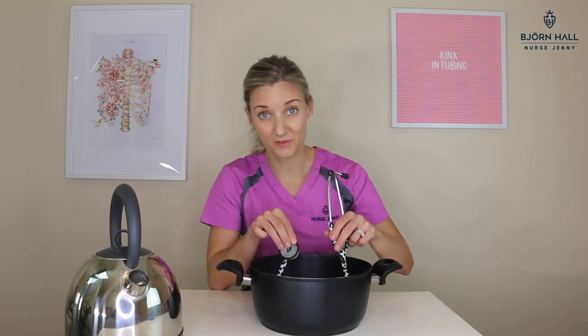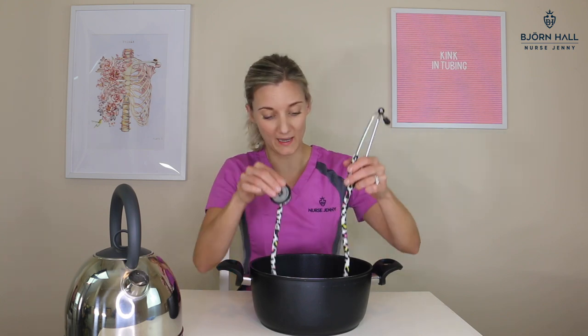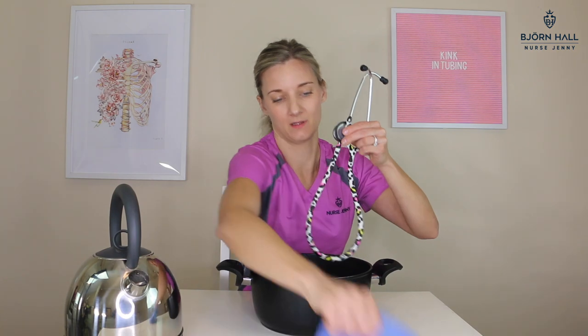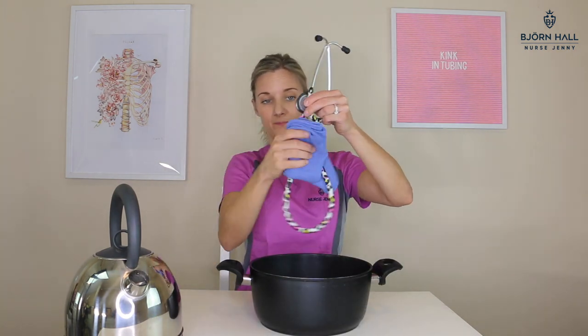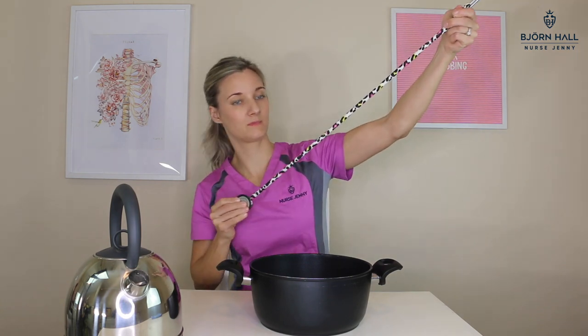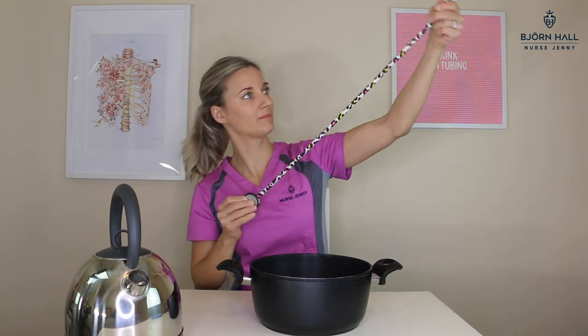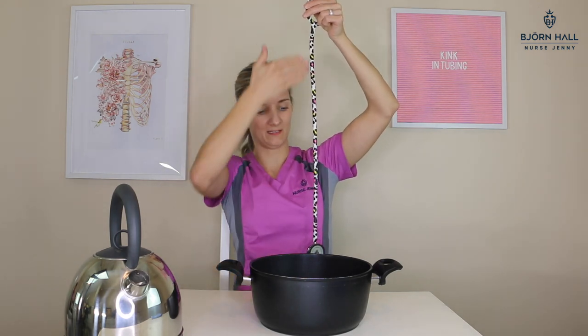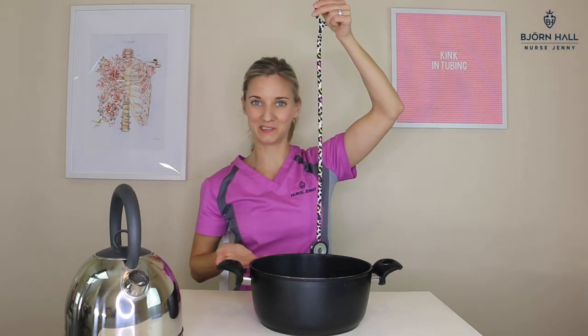Now step three: take the tube out of the water, get a cloth and wipe it down. Give it a gentle tug. And voila, your stethoscope is as good as new and completely straight.